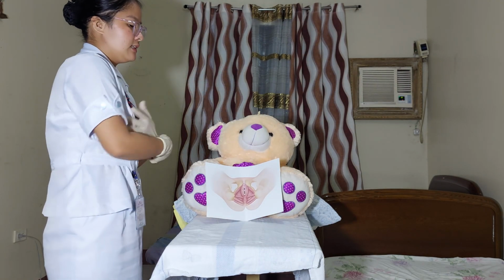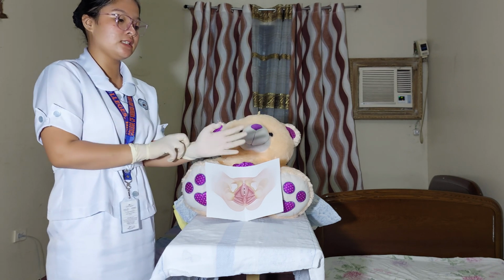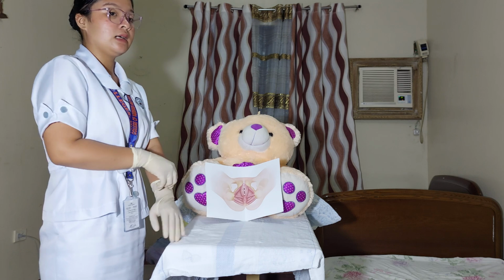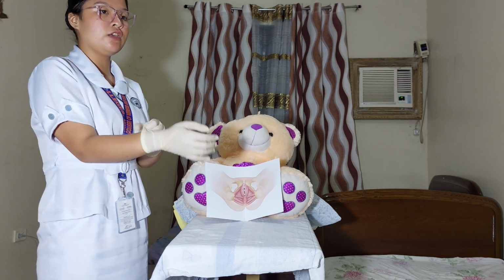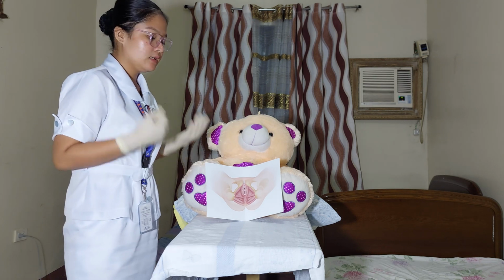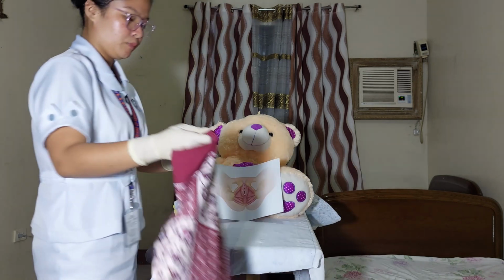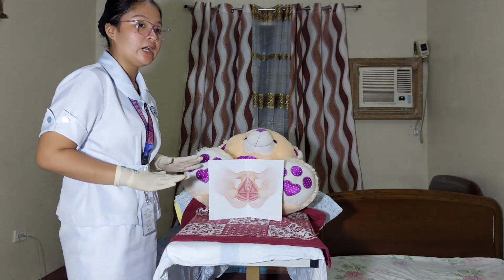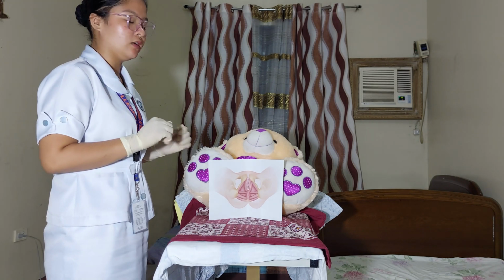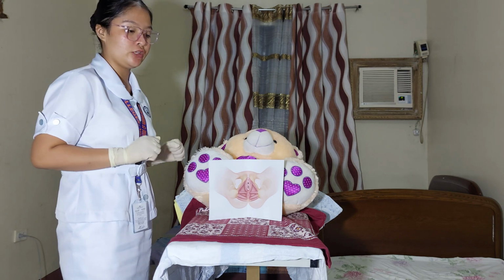Another thing is I'm going to put a protective pad under my patient's butt para masalo niya if may urine man na lumabas, ay may urine man na mag-spill sa procedure na to. So, ma'am, can you lift your butt po para malagyan natin ng protective pad? So, now that the protective pad is okay na, ang gagawin ko naman is i-drape ko yung patient ko.